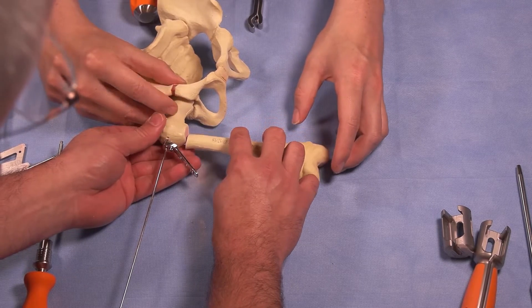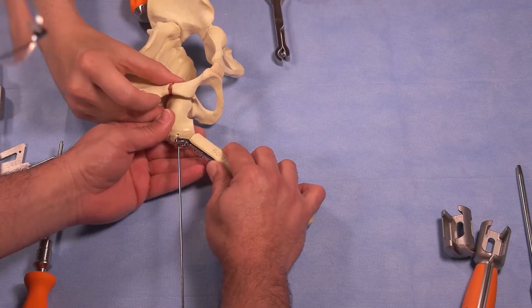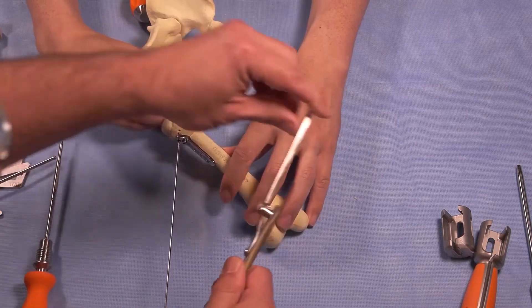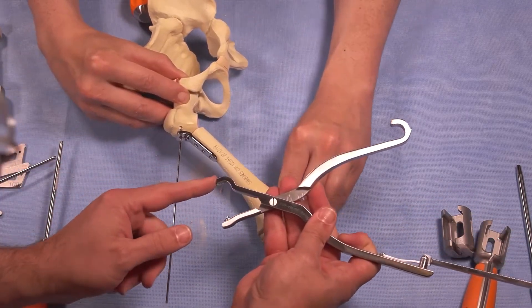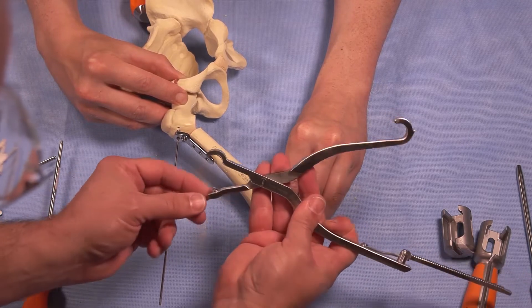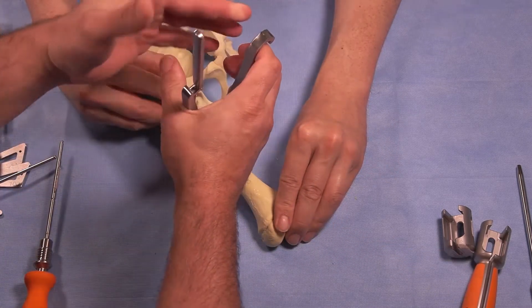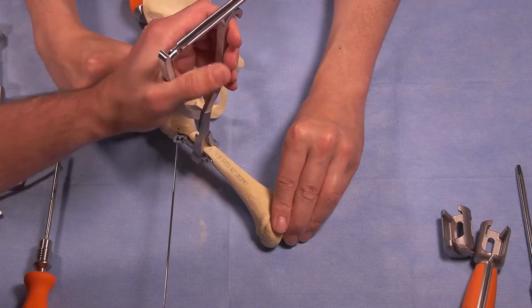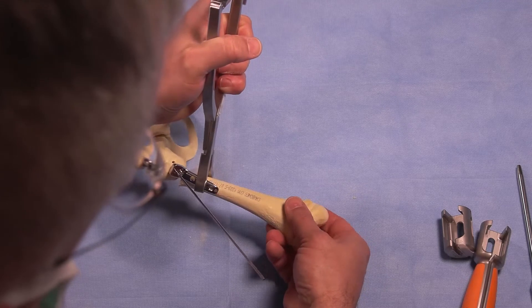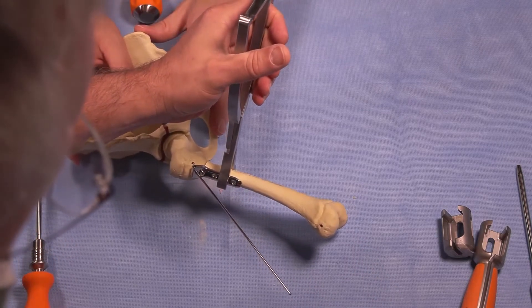The next step is to reduce the shaft to the proximal segment, and you can hold that in place with the verbruge. This is a specially designed verbruge with a different circumference — there's a small and medium for the child and infant, and a larger one for the adolescent. It has a little inset dimple nipple that goes into the hole and holds in a great fashion. With this verbruge system you can get a lot of control with rotation — you can dial in rotation, clamp it, and it'll hold well.